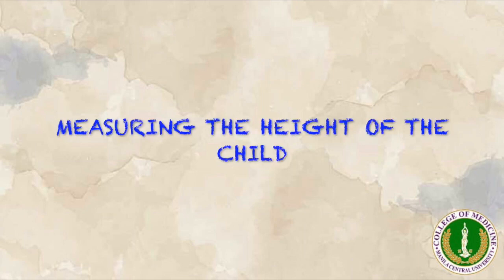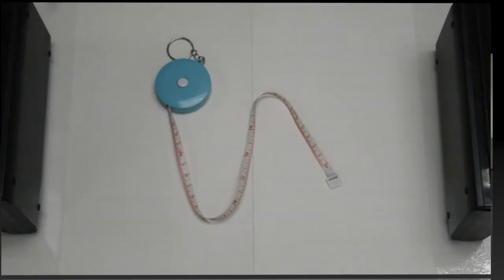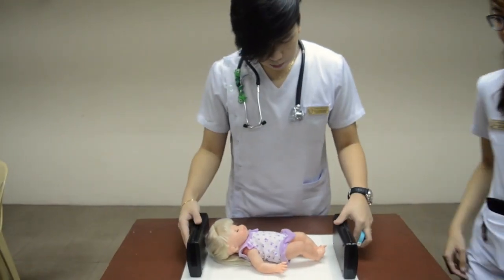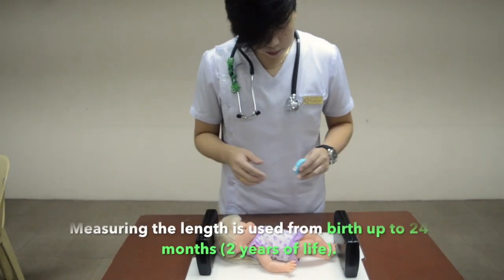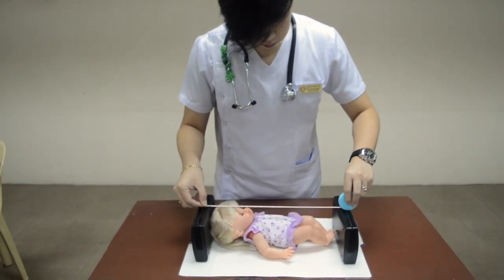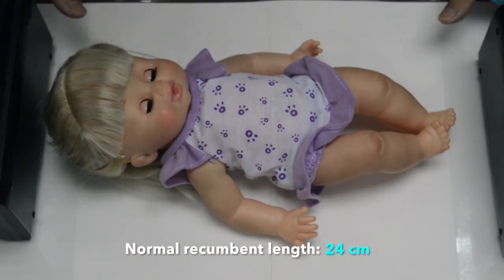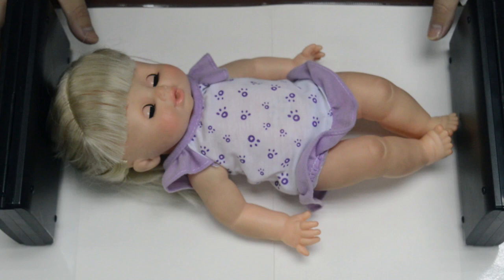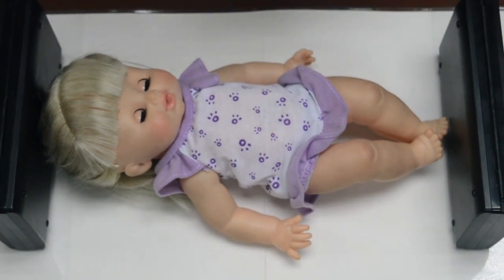Length, or recumbent height, is the measure of a baby when lying down in supine position. It is used from birth to 24 months as it is common to have lordosis in this age. To measure the baby's length, the parent or assistant holds the infant's head against a headboard. The legs are held straight by grasping the knees with the feet flat against the footpiece.